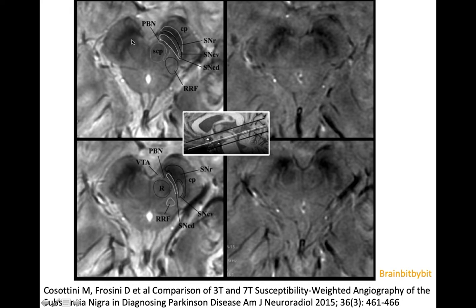On the 7 tesla images you can see that the substantia nigra consists of two different parts. On the anterior and inferior side is the pars reticulata with inhibitory GABAergic neurons. Behind that is the pars compacta, located dorsal and superior, with the dopaminergic neurons that are lost in Parkinson's disease. The dopaminergic neurons are slightly hyperintense on T2-weighted images.